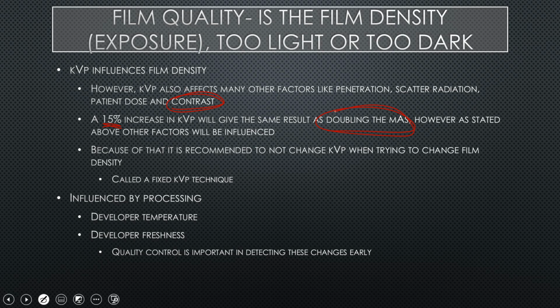Also, the film quality is influenced by processing, the temperature of the developer, the freshness of the developer, also making sure nothing's expired.